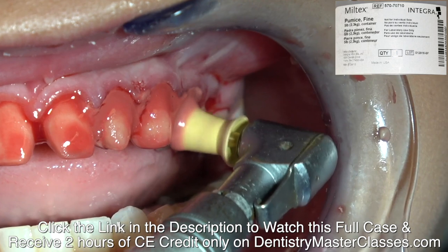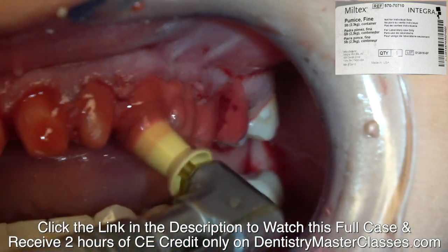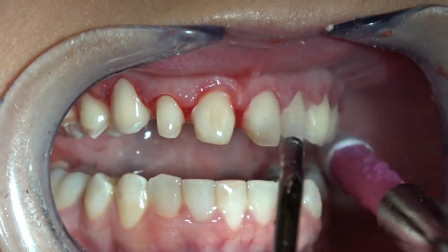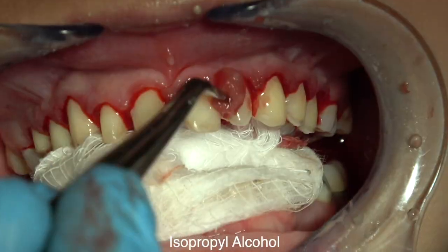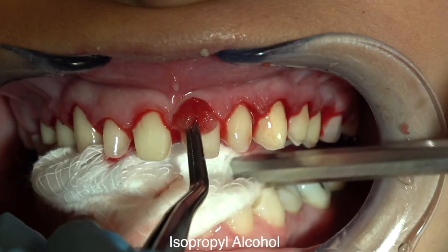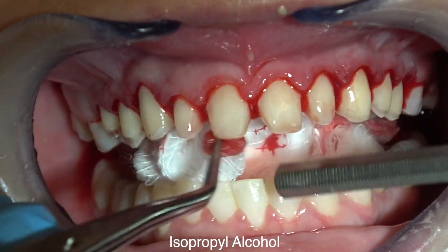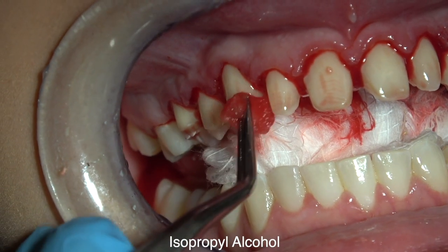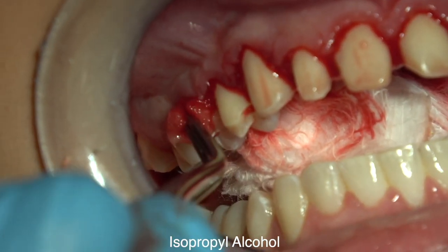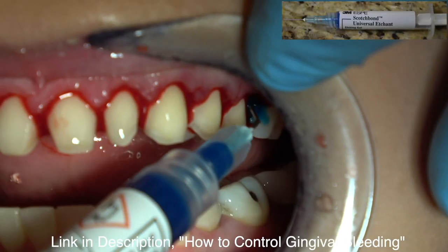I can't remember if this woman was taking aspirin or Midol or Advil for some other issue, but she did have a lot of bleeding and sometimes that's just something you have to deal with. So now I'm wiping the teeth with isopropyl alcohol — these preparations were all in enamel and this just removes any little bits of debris that you couldn't remove with the pumice and water in the profi cup.